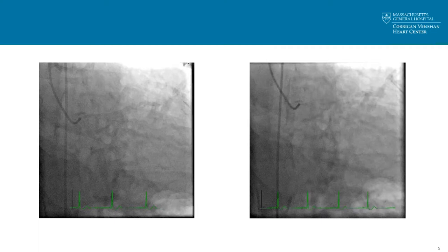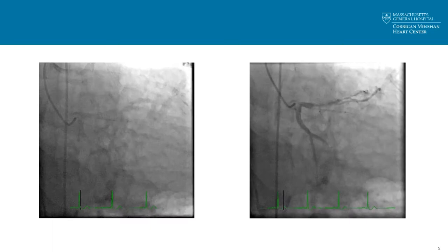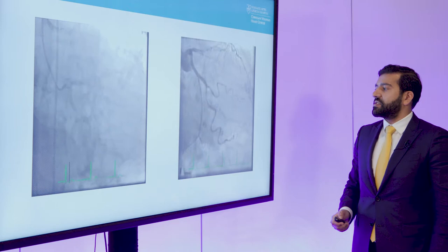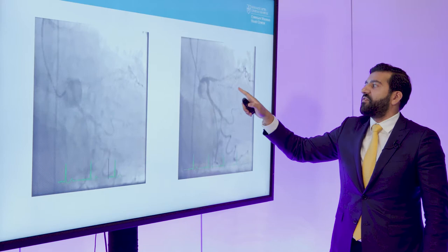Here are his diagnostic films of the left system. You can start to appreciate some left main disease with deep calcium. He has LAD disease, and you can also see calcium in the circumflex with mild disease distally. These are orthogonal projections of the left system. In the LAD you can see fairly significant disease, and when the contrast doesn't fill, you can see a significant degree of calcification.